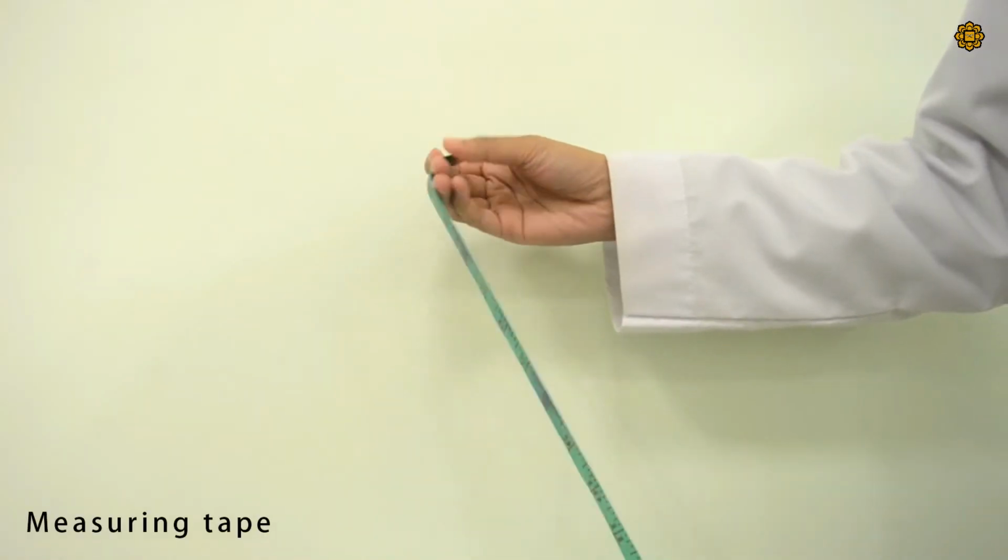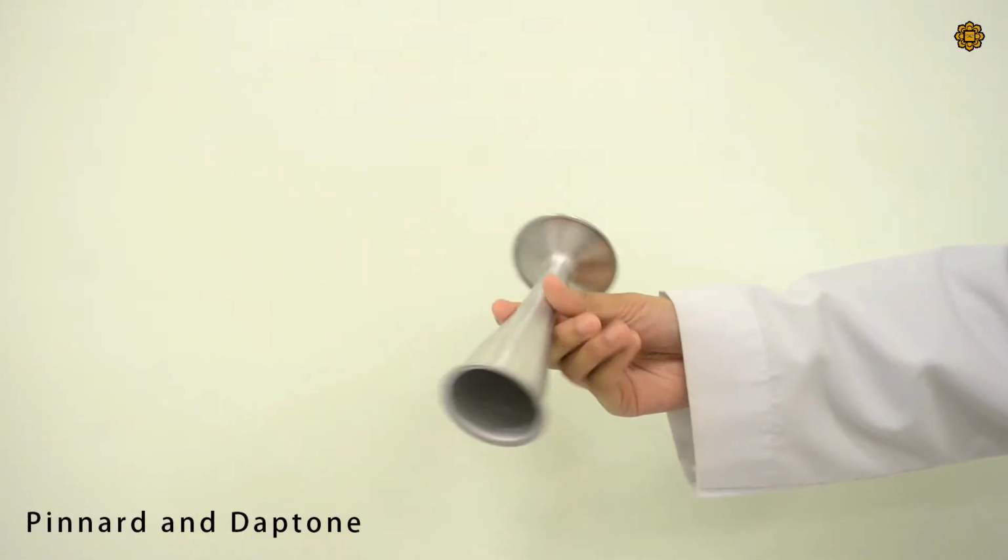Equipments. We'll need a measuring tape, Pinard stethoscope, and Doptone.